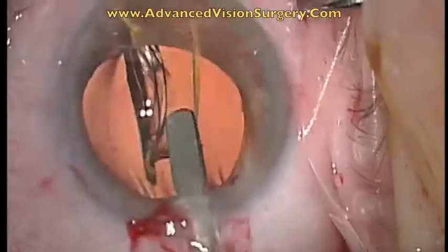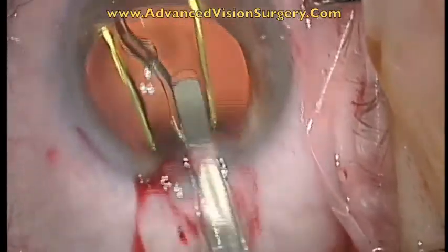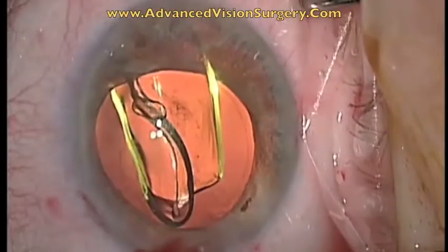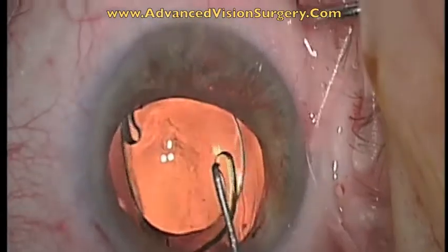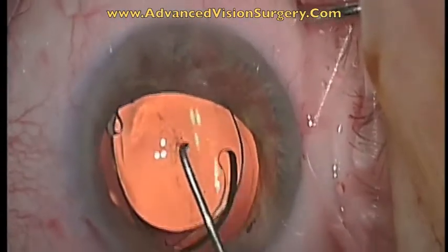The cataract was first removed and an intraocular lens implanted through a 2.8 mm incision.